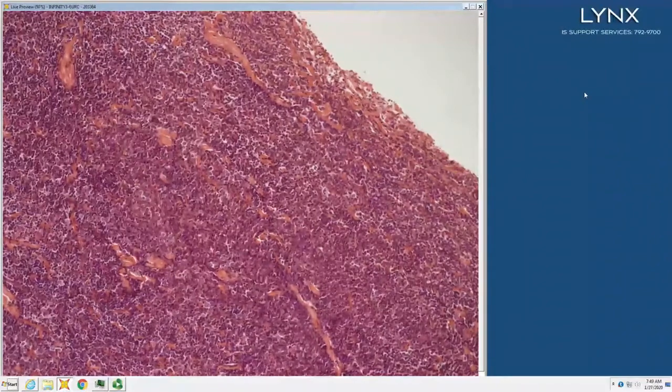It's a T cell infiltrate that often damages tissue but is driven by a clonal B cell population. Sometimes you have to ferret them out by which one has the clone and which one is the ugly cytologically population versus the one that is morphologically normal population.